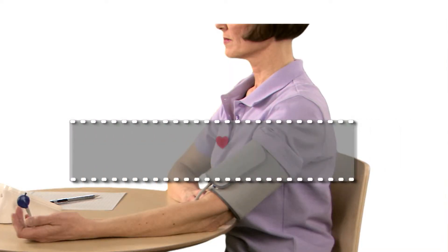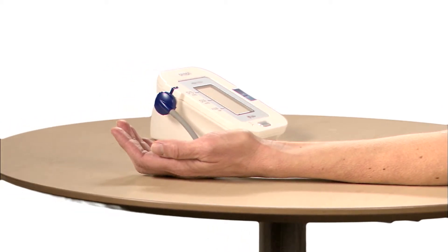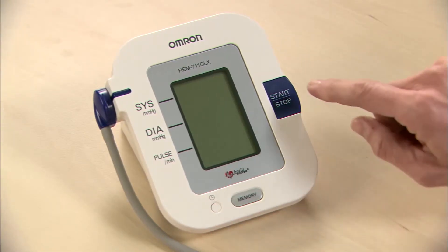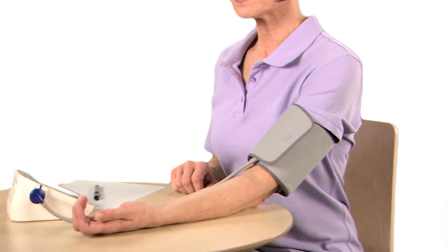Place your elbow on a table so the cuff is level with your heart and your left palm up. To turn the unit on and take a measurement, press the start-stop button once. Sit straight and do not move during the measurement.